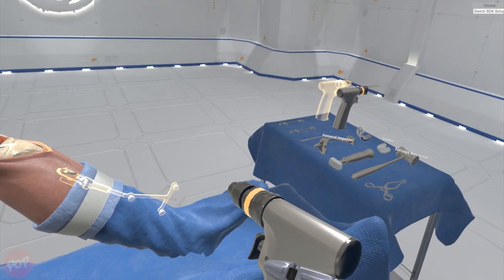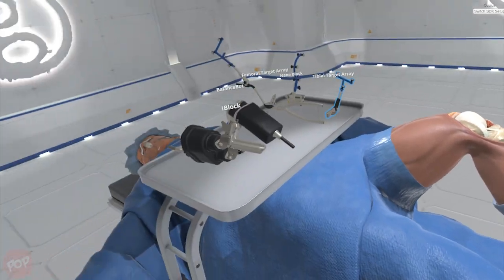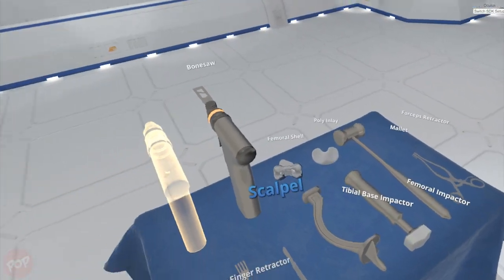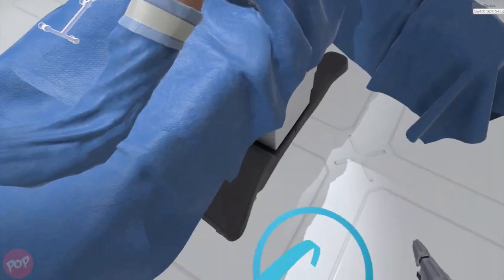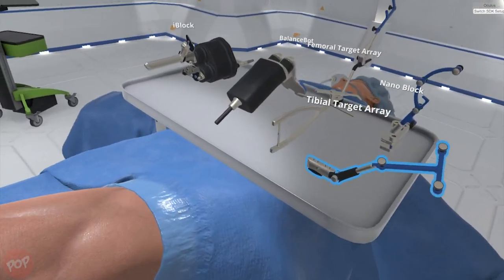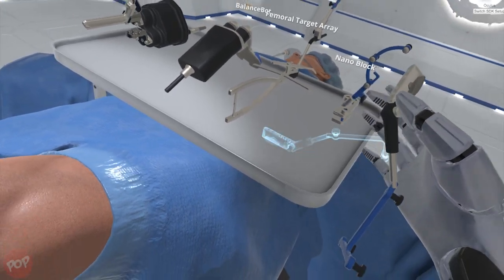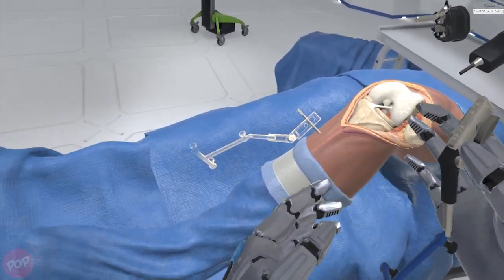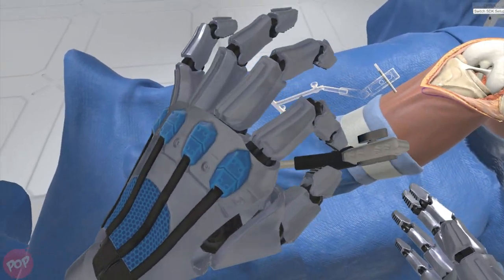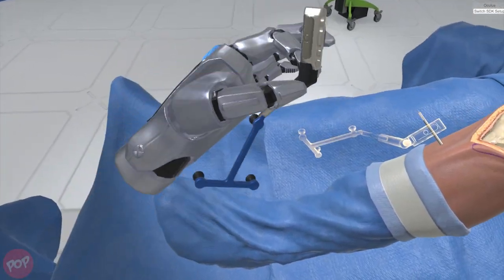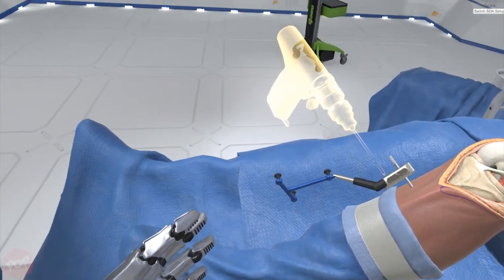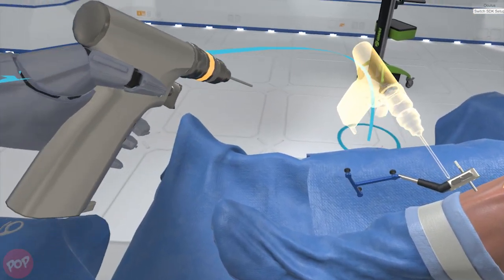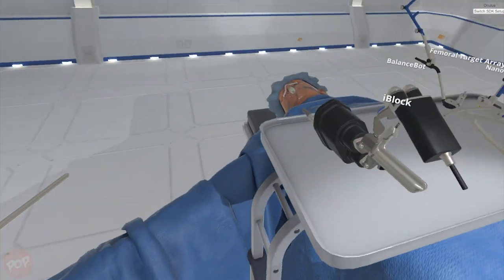Select the tibial target array already mounted to the universal 2-pin fixation block. Place it over the anchor pin you previously installed on the tibia. Grab the pin driver and pull the trigger to install the anchor pin and secure the tibial array to the anterior tibial cortex.